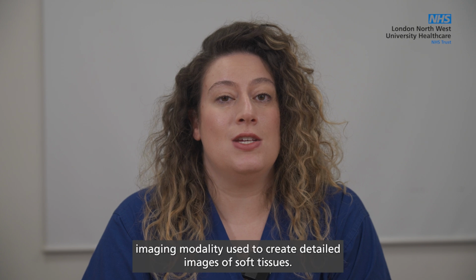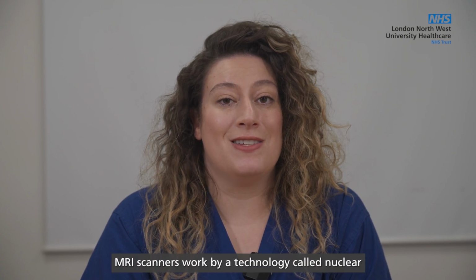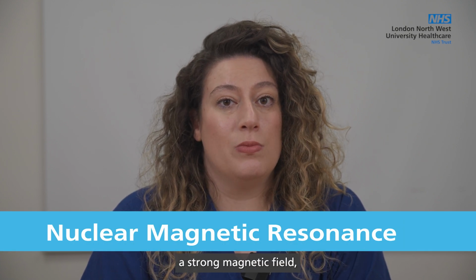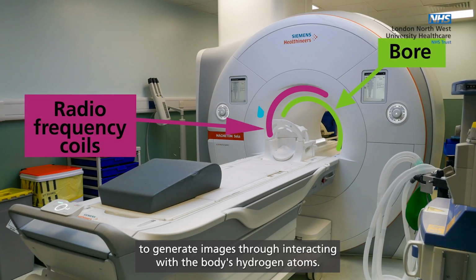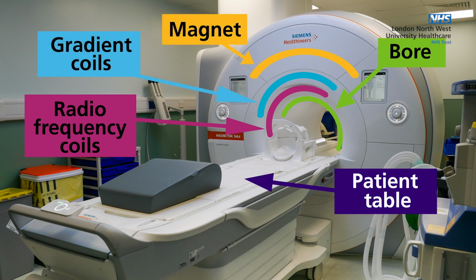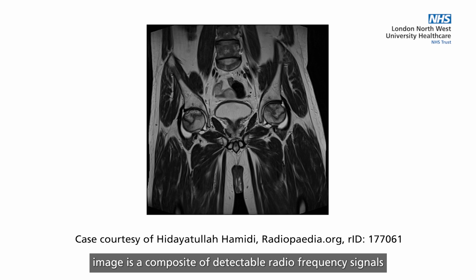MRI is a commonly used imaging modality used to create detailed images of soft tissues. MRI scanners work by a technology called nuclear magnetic resonance, which incorporates a strong magnetic field, gradients, and radiofrequency pulses to generate images through interacting with the body's hydrogen atoms. A final MRI image is a composite of detectable radiofrequency signals from the different hydrogen densities of different tissues.